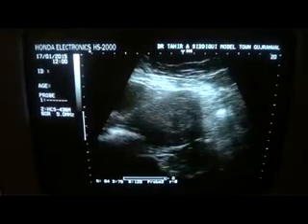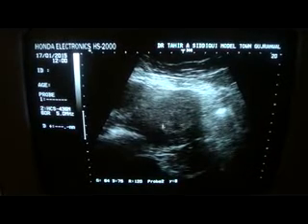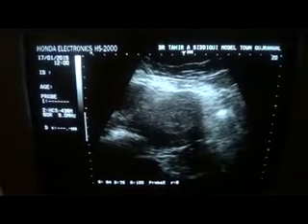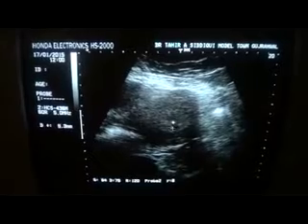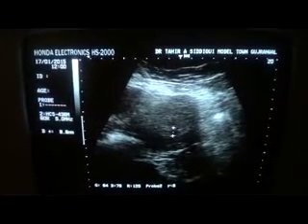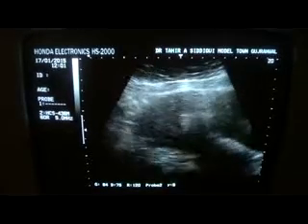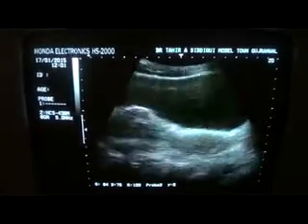This is a small tiny cystic area with an echogenic rim around. This cystic area is consistent with a gestational sac, deformed gestational sac, in a patient with history of bleeding and pain for the last 4 days. This is consistent with incomplete abortion at this present day of ultrasound.